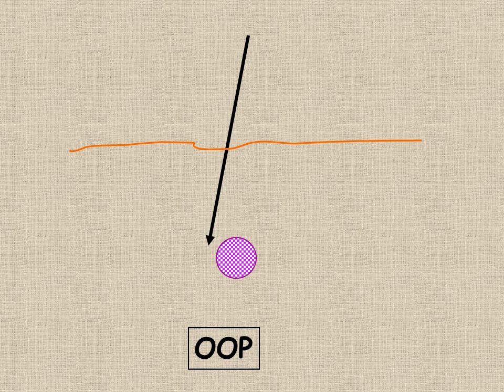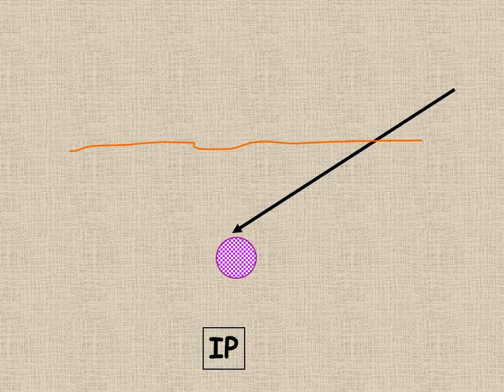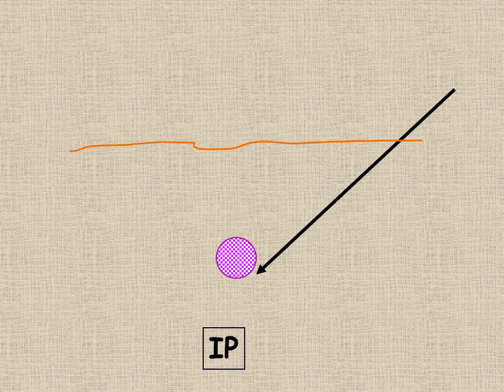Finally, when approaching nerves, it is advisable to approach to one side or the other for an out-of-plane approach. And we will inject local on both sides of the nerve, on this side and that side. Conversely, for an in-plane approach, we will aim for the top and bottom of the nerve, rather than aiming again for the center of the nerve.